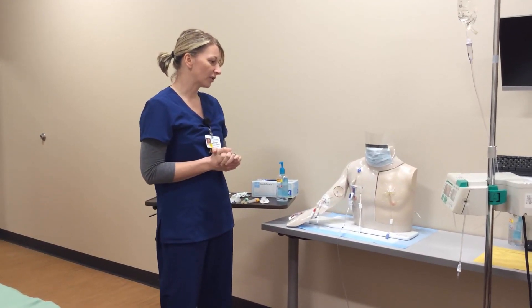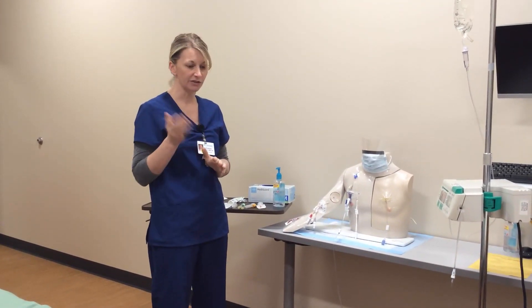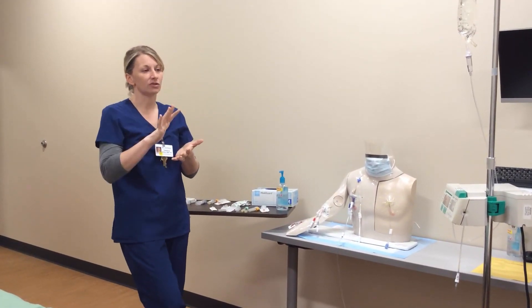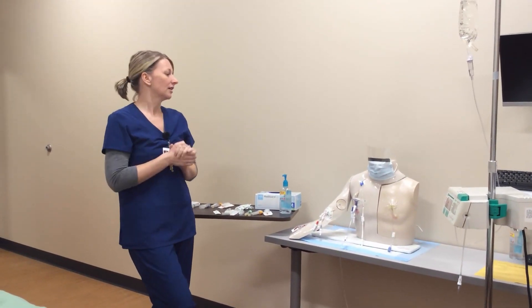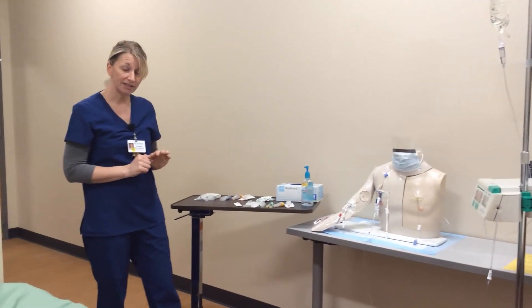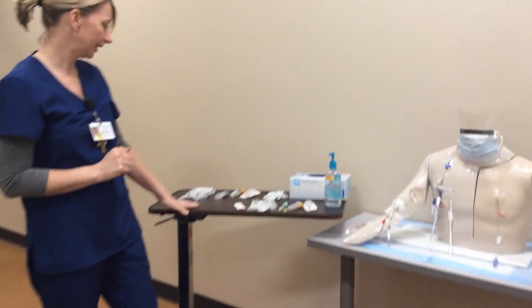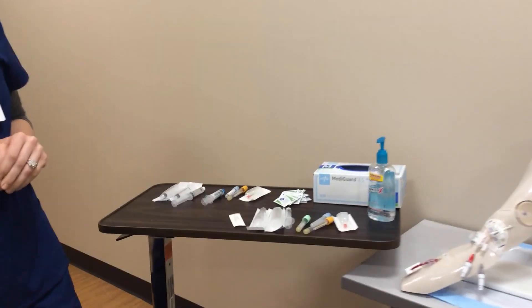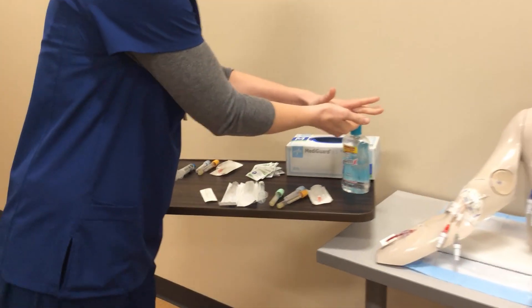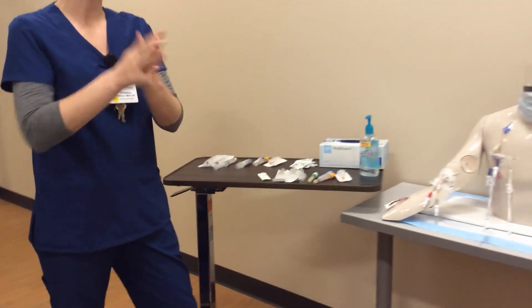The first thing you're going to do is look at your physician's order and confirm it makes sense for the patient to have blood drawn today. Once confirmed, go ahead and grab all the supplies you need, which I have prepared ahead of time. Walk to your patient's room and perform hand hygiene.